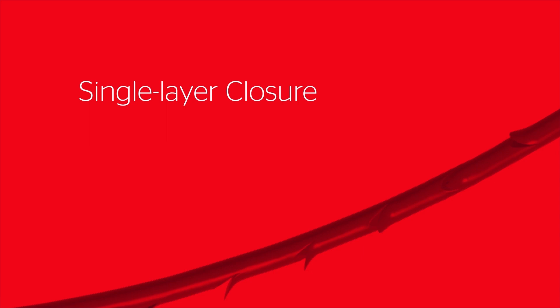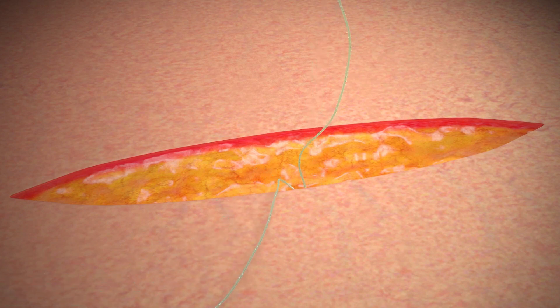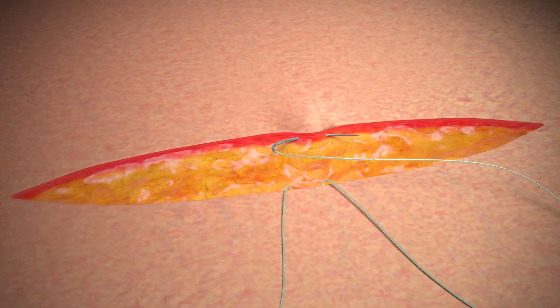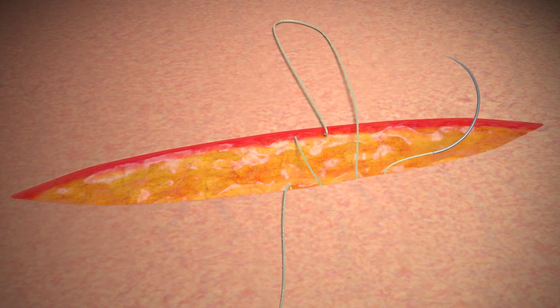Bidirectional Stratafix devices can be used for single layer closure. Surgeons begin at the middle of the incision and pull the device until it catches at the transition zone. The suture is then used in a continuous suturing fashion along both sides of the incision.